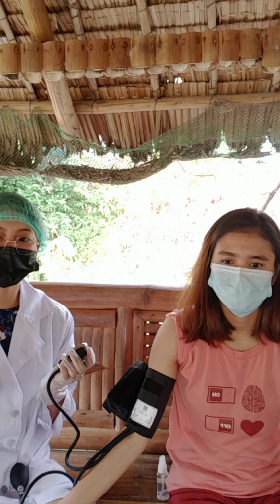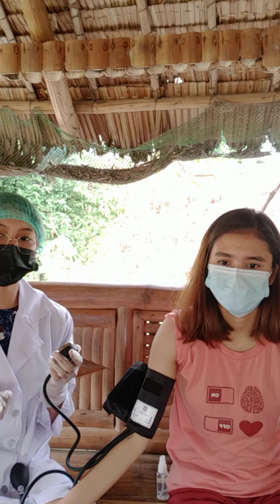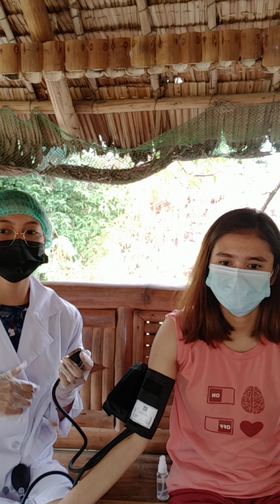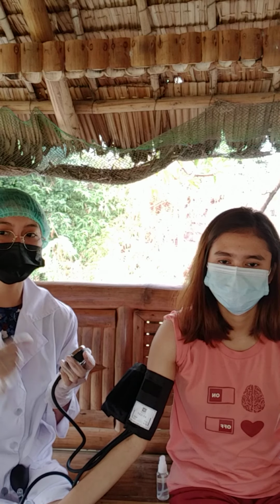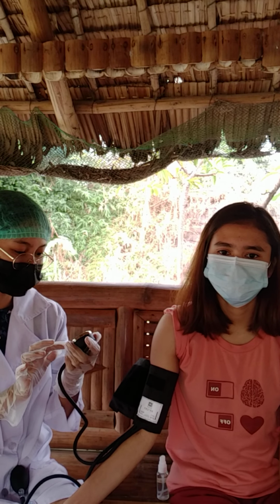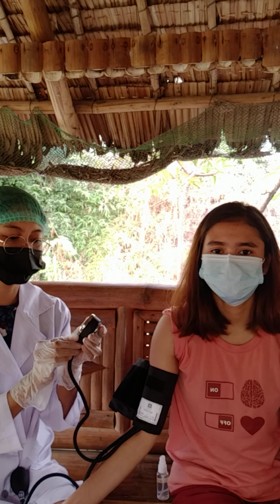And then after that, if using manometer, check to see the manometer is in the vertical position and the mercury is within the 0 level with the gauge at eye level. So, nasa 0 siya.